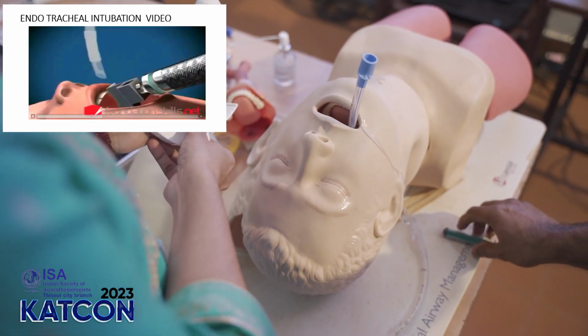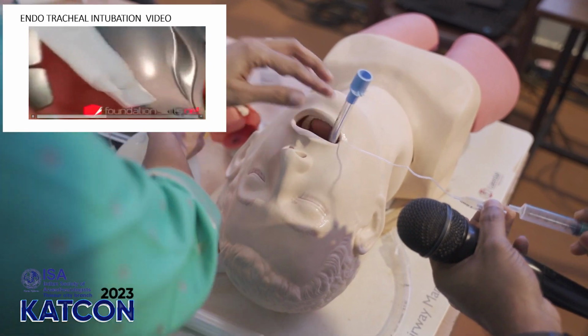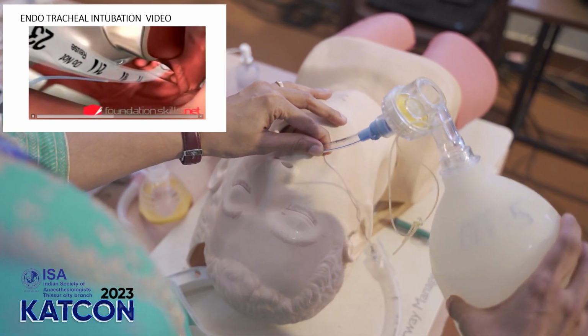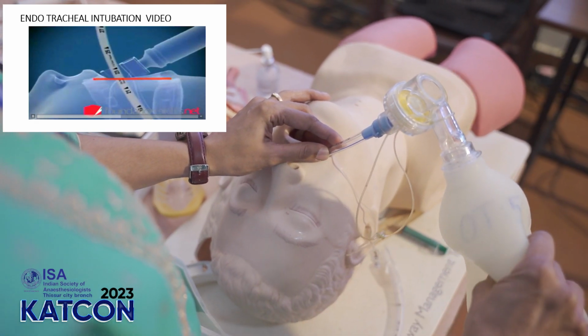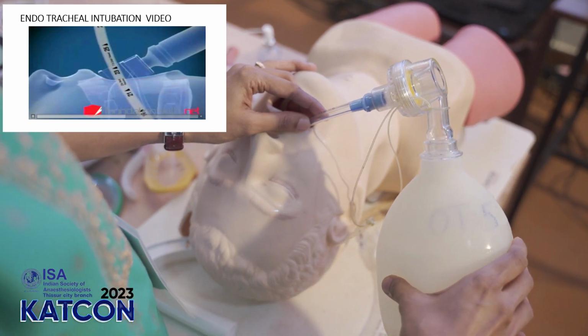With the right hand, insert the endotracheal tube from the right-hand side of the mouth. Once you see the vocal cords, you can insert the ET tube directly between the cords and into the trachea until the cuff passes through the cords. The markings on the tube at the incisors will show between 21 and 24 centimeters in the average-sized adult when the tube is in position.